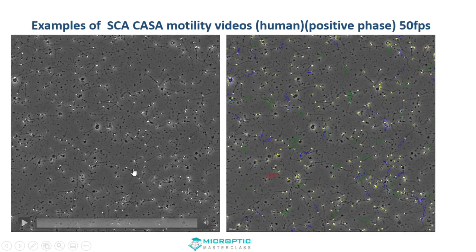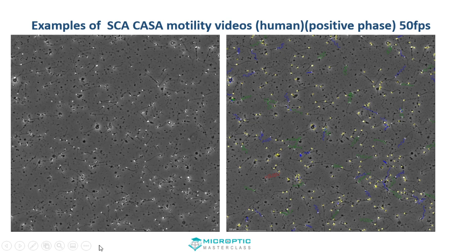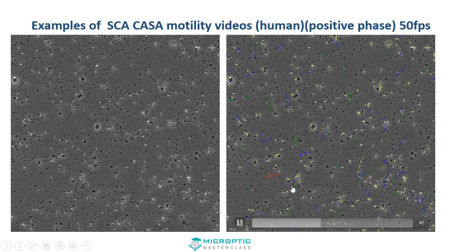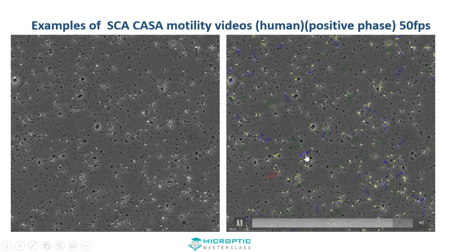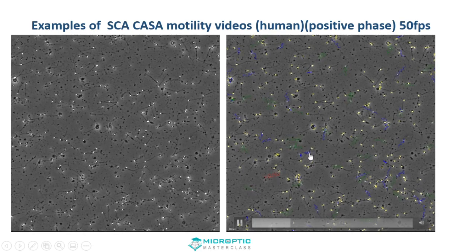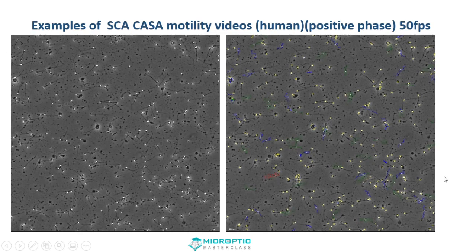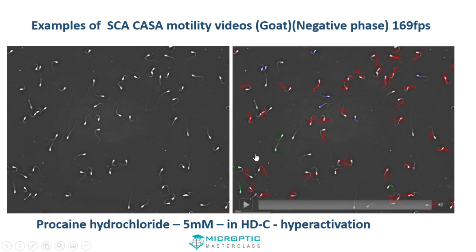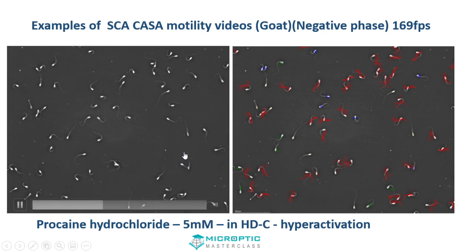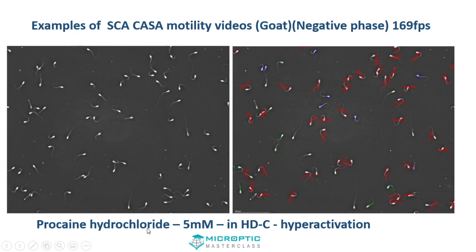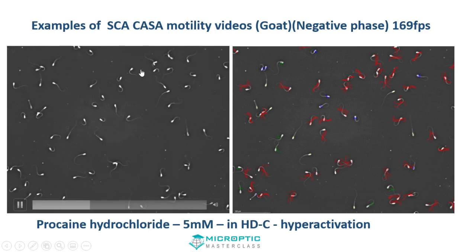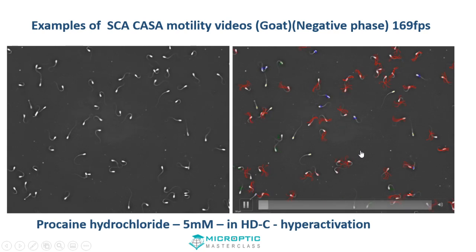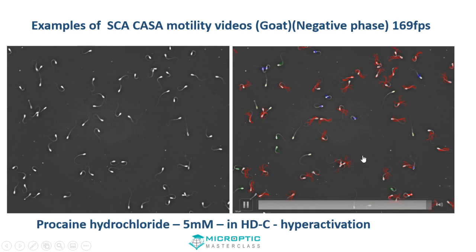Let's first look at motility of human sperm in semen. You can see the sperm swimming in a pretty challenging environment with lots of prostatic particles. This is how the SCA CASA analyzes it — the red sperm is fast progressive, the green one is less progressive and less fast, and the blue one is not really progressive. This is also shown in negative phase contrast, where for example tankwa goat sperm at a high frame rate of 169 frames per second are really hyperactivating in a star-spin pattern. Here you can see how the tracks are reconstructed in the sperm class analyzer with all parameters recreated.